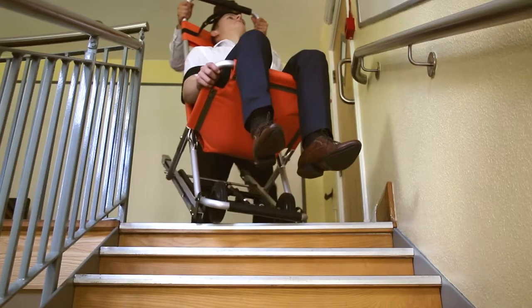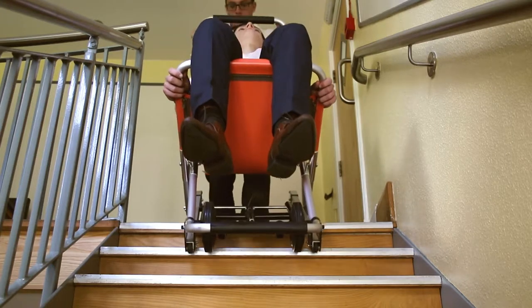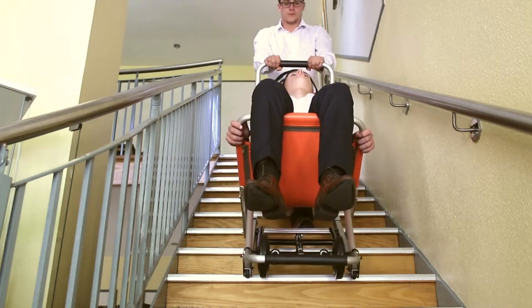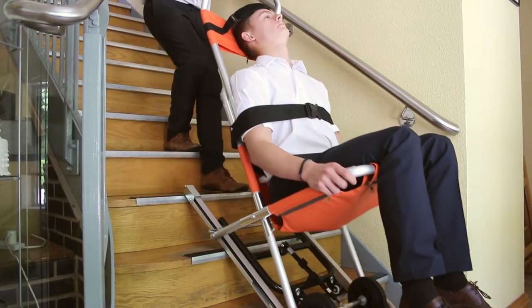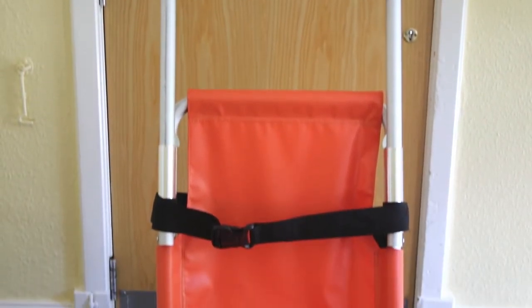The Relequip evacuation chair features an advanced track design, allowing use by a single operator. The chair glides effortlessly down the steps. When negotiating the bottom step, wheel the passenger clear of the staircase, far enough to re-engage the rear stabilising wheels.